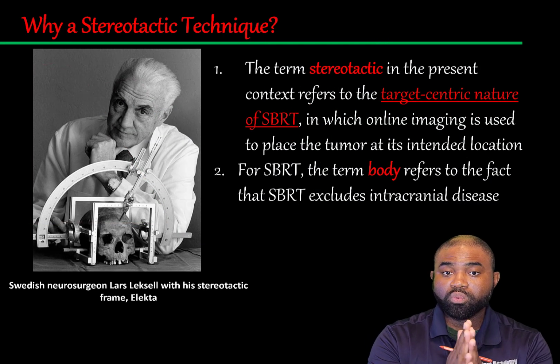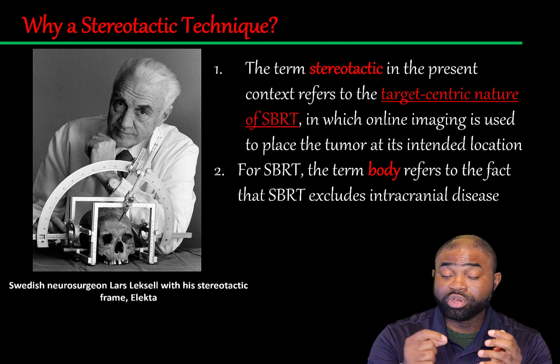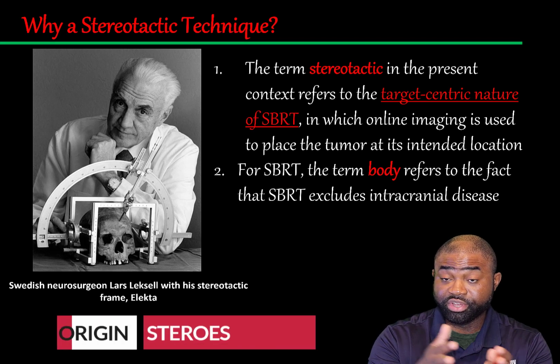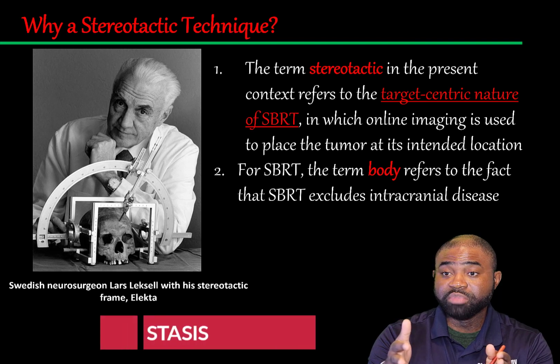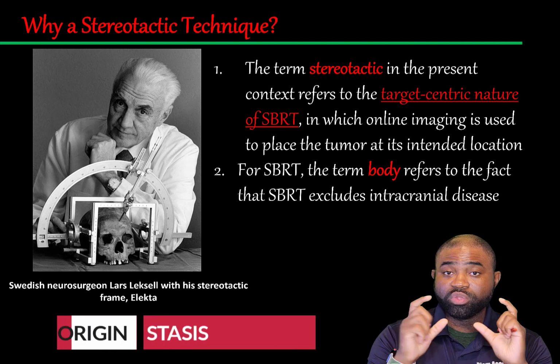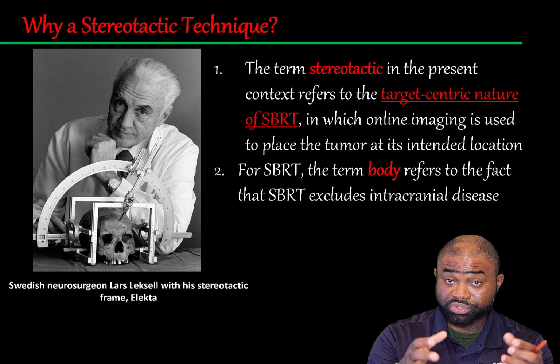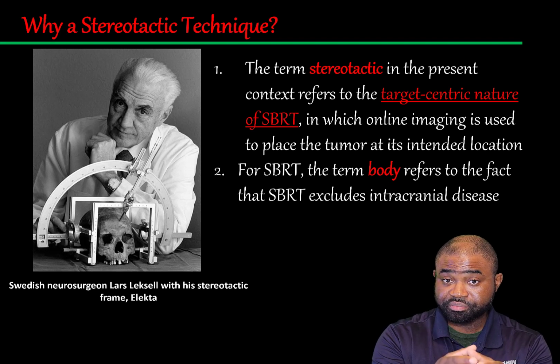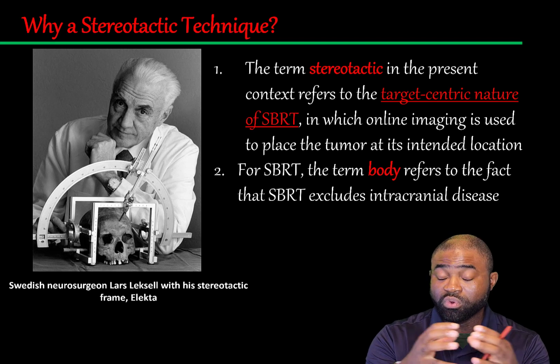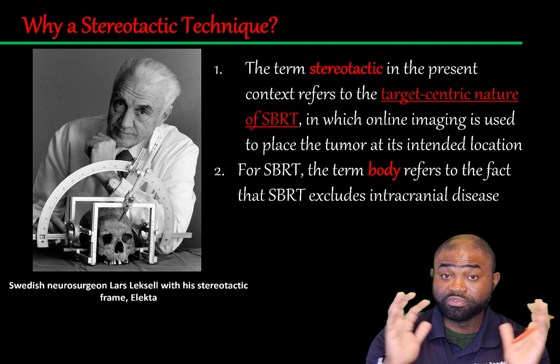Now, the word stereotactic used in both cases originates from a Greek word, stereos, which means solid, and taxis, which means order. The word stereotactic is typically used to define a three-dimensional localization of a point in space by a unique set of coordinates that corresponds to a fixed external reference frame.